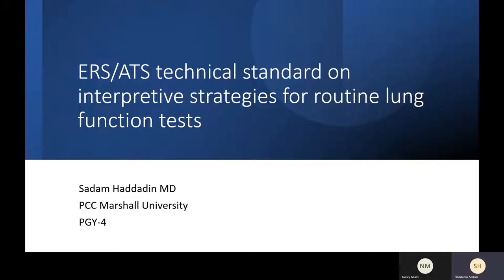The other important thing is about the sex and the gender identity. We have to use the biological sex, not the gender identity. It's also important for transgender patients, especially when they use hormone replacement therapy, so it can affect the lung function. If they use the hormones during young age or adolescence, it also affects lung growth.